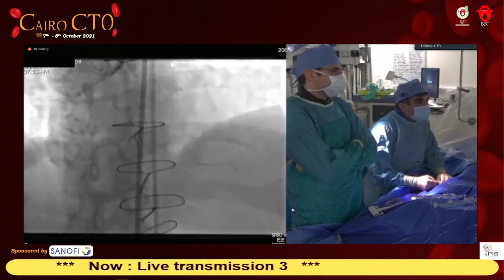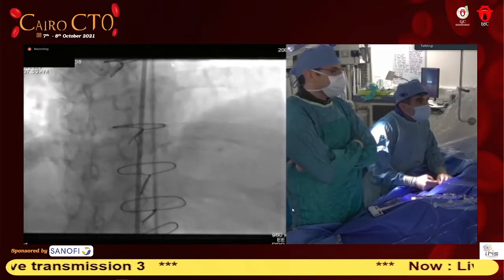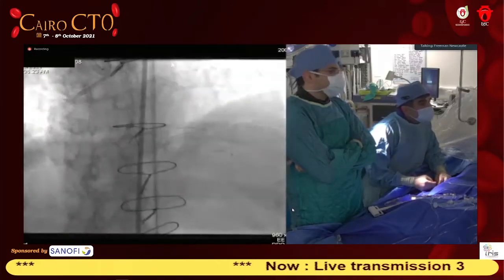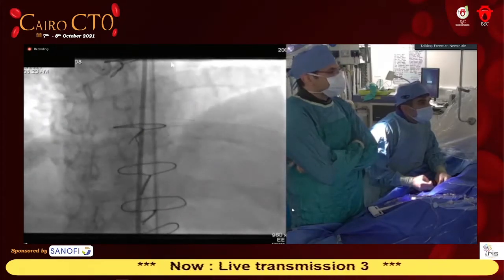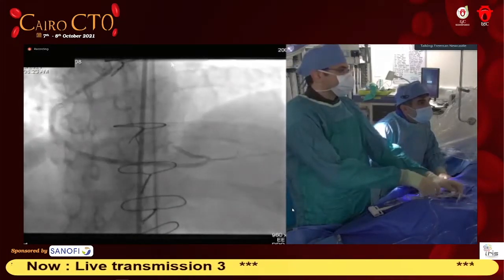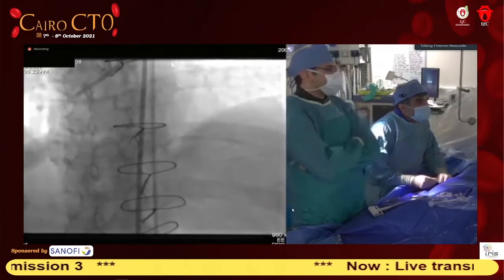Can we change the view slightly to see some angulation, right? Oh, the angulation, right. Okay. Yeah, I'm sure we can, but I just want to get this wire a little bit more distal, or to the vein graft itself, actually. Let's test retrograde, Ahmed, please. Yeah, I could see my control of the wire is really difficult with the severe angulation. There you go, that's better.